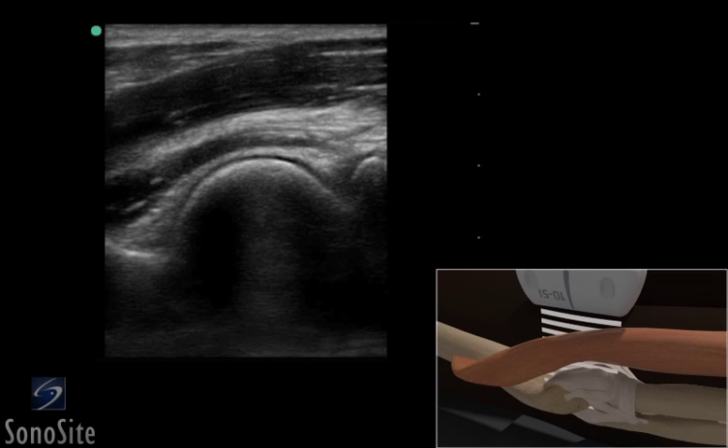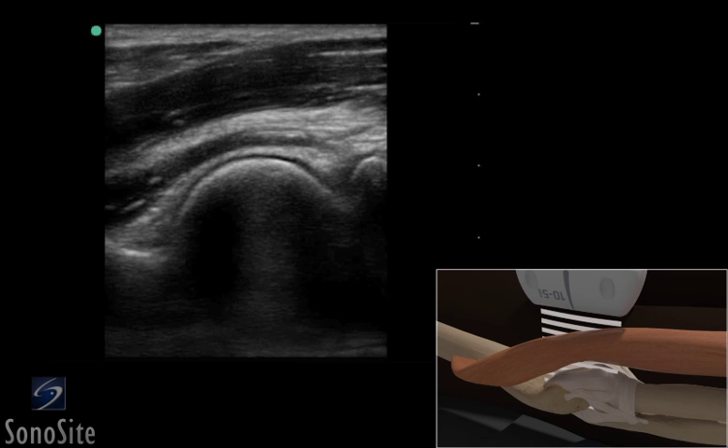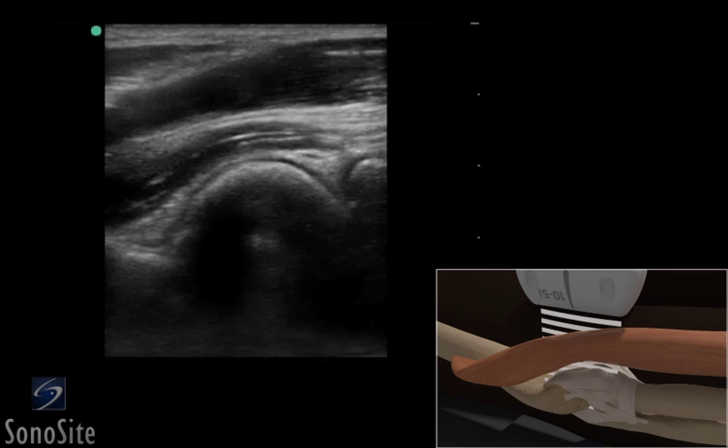A linear array transducer with a musculoskeletal exam type is used to perform an ultrasound examination of the anterior recess of the elbow.